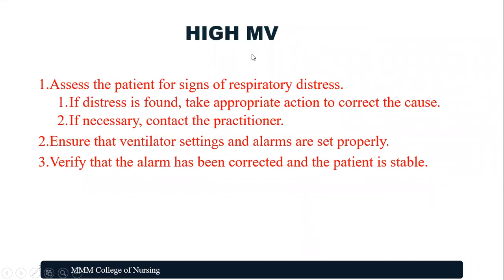High minute volume. Assess the patient for signs of respiratory distress. If any respiratory difficulty or distress is found, take the appropriate action to correct the cause and call the intensivist if required. Ventilator settings and alarms need to be set properly before leaving the patient unattended.